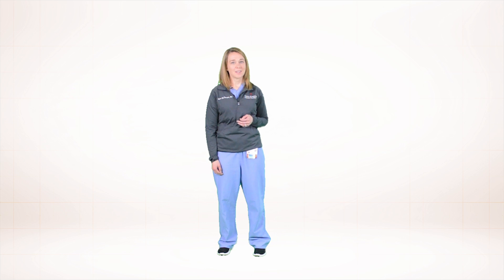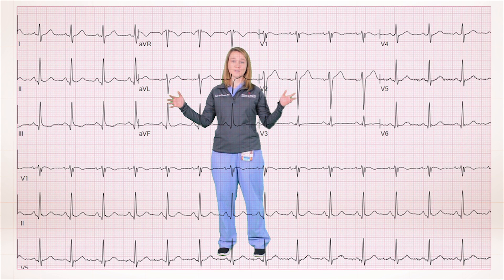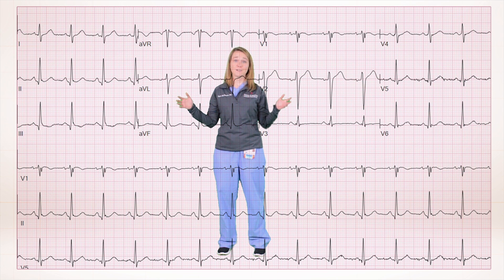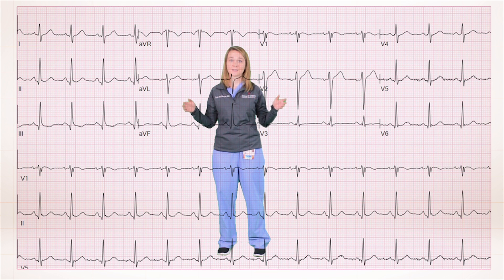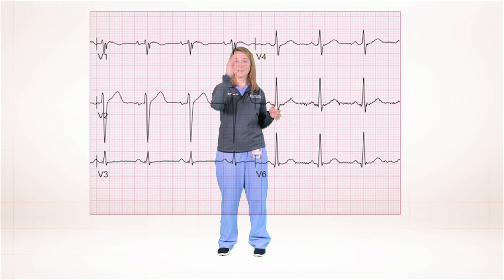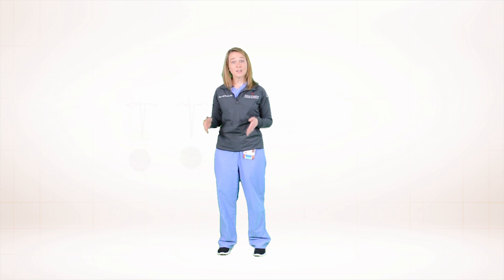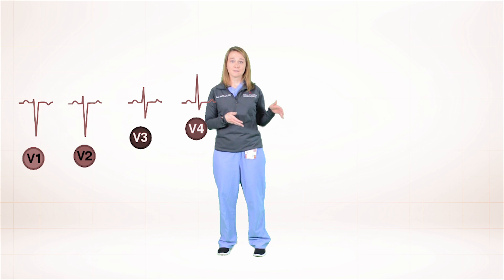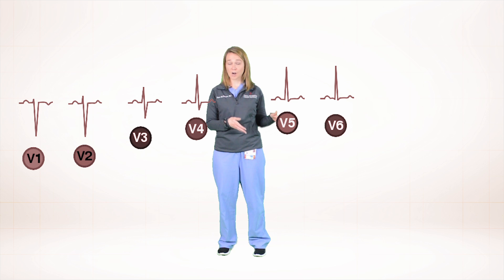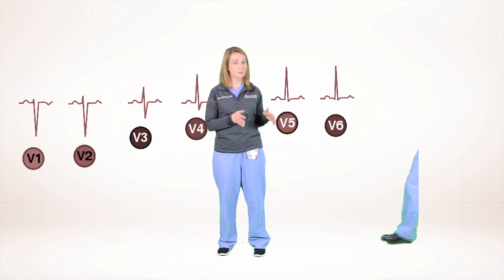Let's take a look at how differently they can look by pulling up another 12-lead EKG. You can see there are a variety of QRS complexes depending where you look. I like to focus on the precordial leads V1 through V6. In V1 and V2, you'll see a very small R wave — that upward deflection — and then a large deep S wave, all downward deflection afterwards. Then in V3 and V4, the R wave and the S wave are about equivalent. Finally, in V5 and V6, it's mostly just R wave, and sometimes you don't see any Q wave at all — that's okay, it's still the QRS complex.